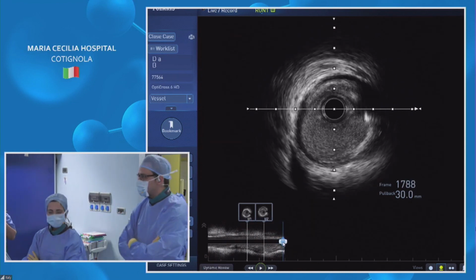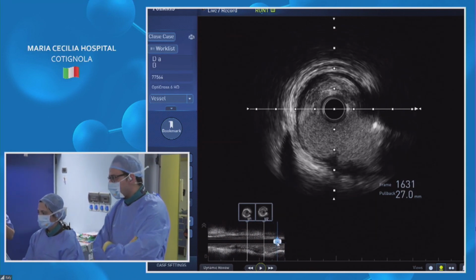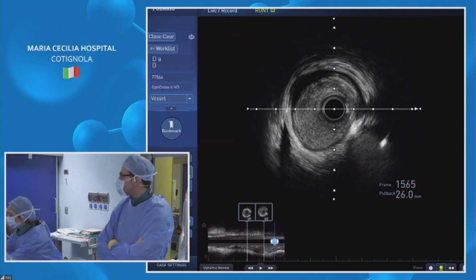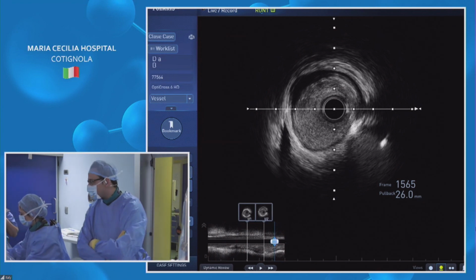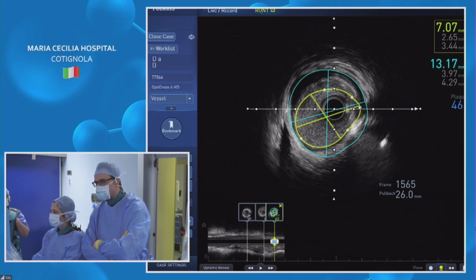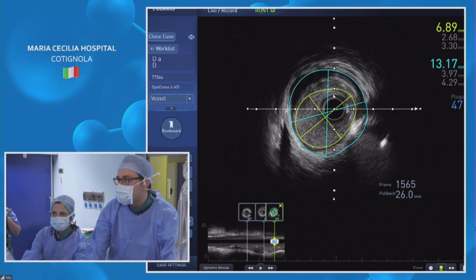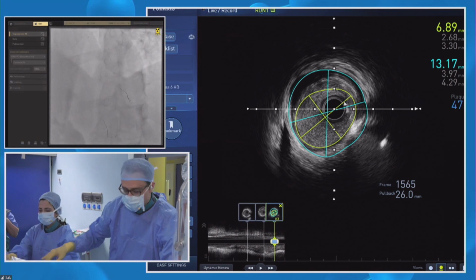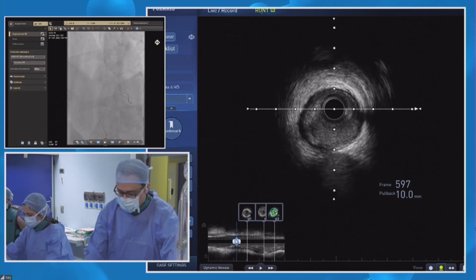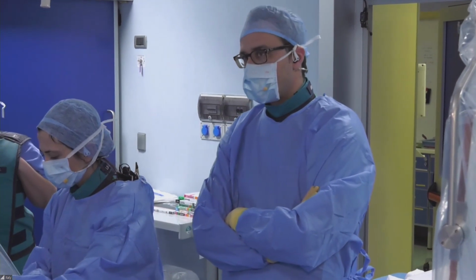So which is your suggestion to manage this case? Would you avoid the left main? Would you protrude a bit into the left main to be sure that we cover all the disease, or would you prefer to land in the ostial LAD, so landing in a diseased segment? Personally, I would go into the left main because the disease is clearly coming up to the ostium, with mild disease in the left main itself, and the origin of the circumflex is free, so very little danger there.